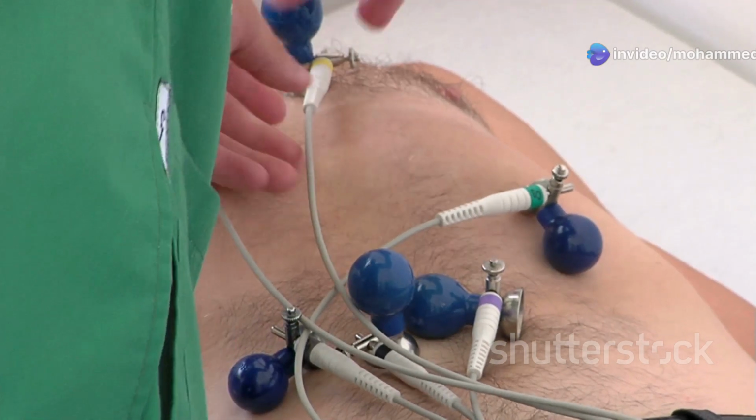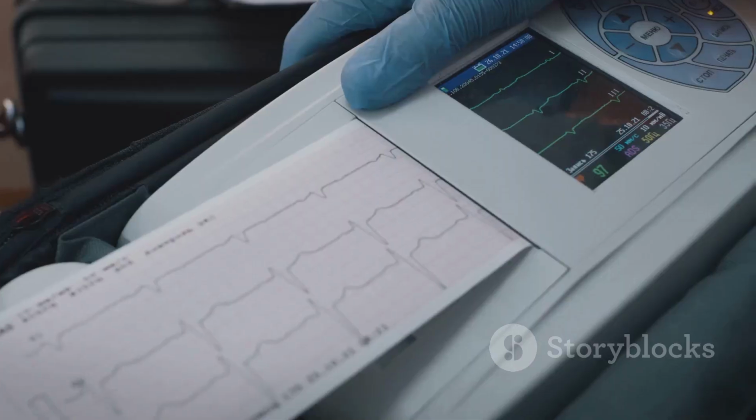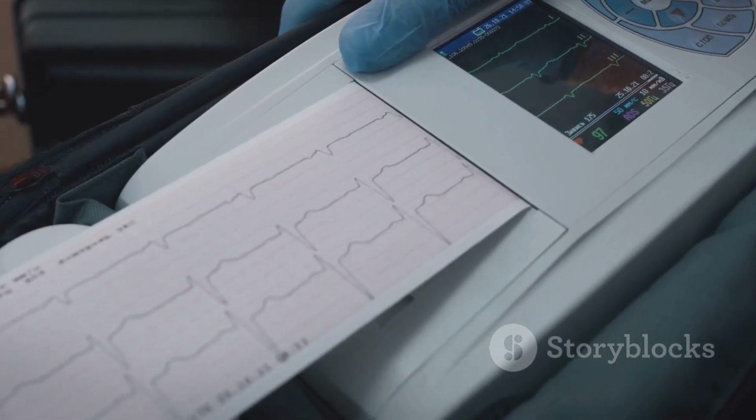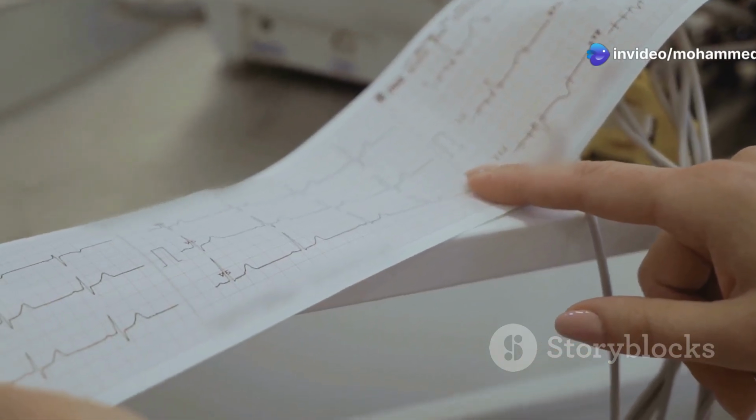The ECG works by detecting tiny electrical signals produced by the heart with each beat. These signals are then amplified and recorded on graph paper or a monitor. The resulting pattern is what we call an electrocardiogram.